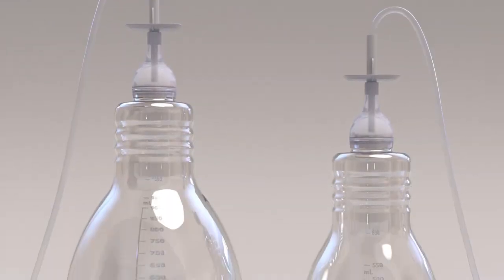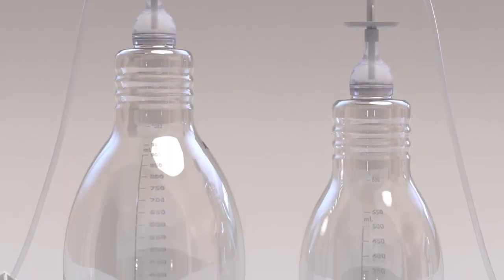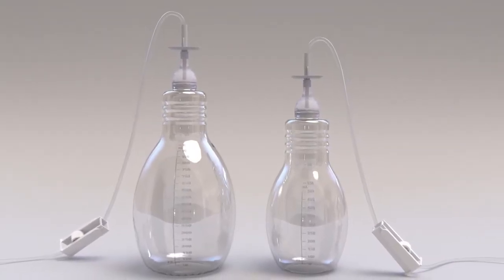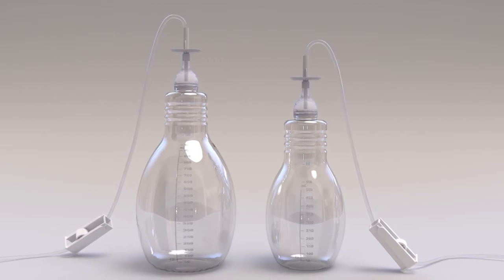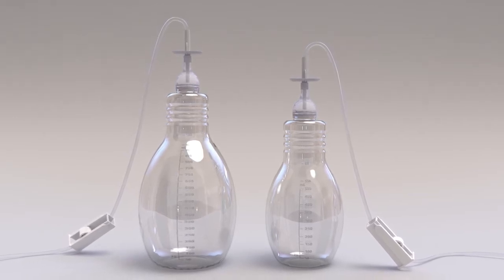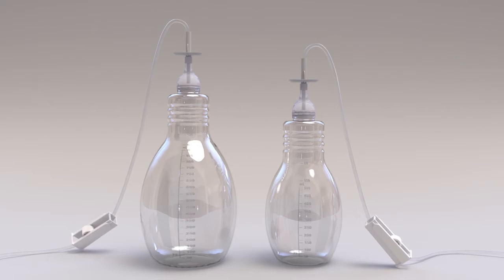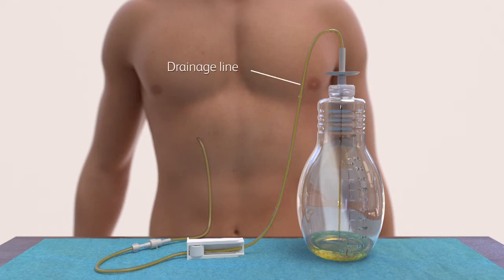You'll drain your fluid into Plurex drainage bottles specifically designed for use with your Plurex catheter. These bottles come in two sizes: 500 milliliters and 1,000 milliliters. Preparation and use of each bottle is the same regardless of size. The active vacuum technology in the Plurex bottles provides suction for drainage and allows you to place the bottle wherever it's most convenient during each drainage procedure.